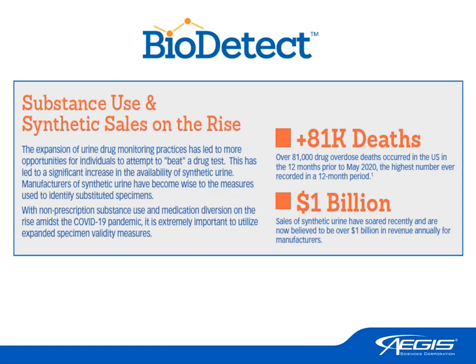The main thing that I wanted to point out is that with the expansion of drug monitoring practices, specifically in urine, this really has led to more opportunities for individuals to attempt to beat urine drug tests. And this has led to an uptick and a significant increase in availability and use of synthetic urines.